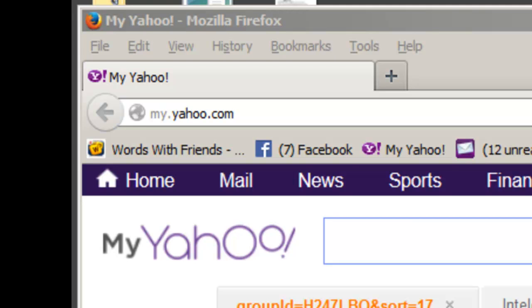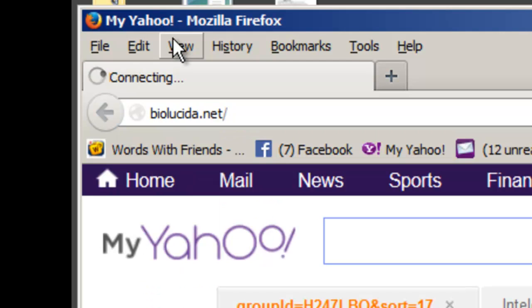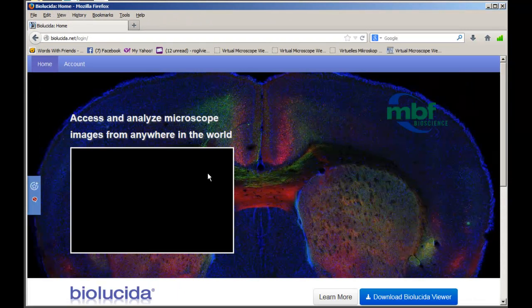This video made by me, Dr. Ogilvy, for the histology class, fall 2013, is going to walk you through downloading Biolucida Viewer from a website that I'm going to type in here right now, and this will follow along fairly close to the instructions that are put on the website.